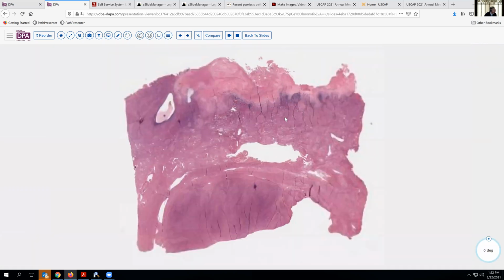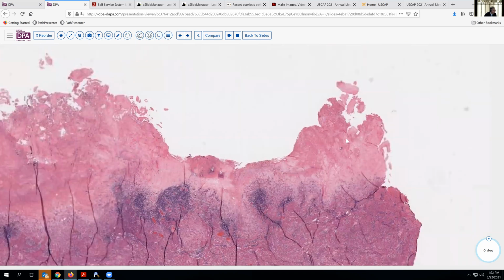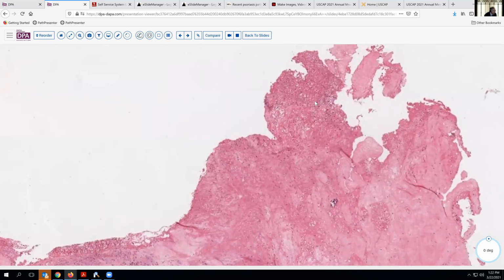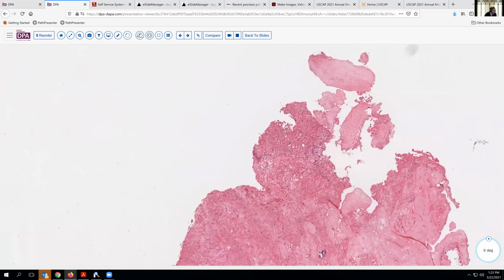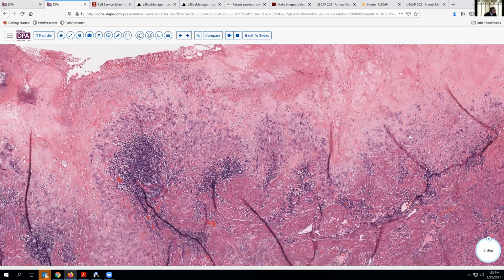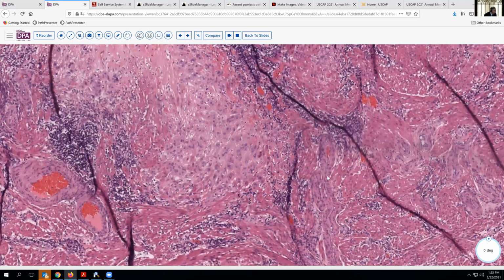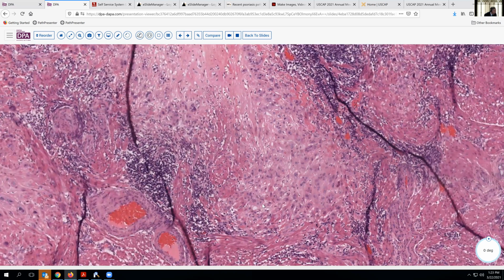Looking here at an exaggerated placental site, we see here the surface fibrin, and we would probably see, if we look here closely, that we have some villus-like structures, sort of mummified here up on the surface, entrapped in this fibrin. And then deep to it here, we have this little thin layer, slightly undulating with abundant trophoblast interspersed amidst the myometrium.